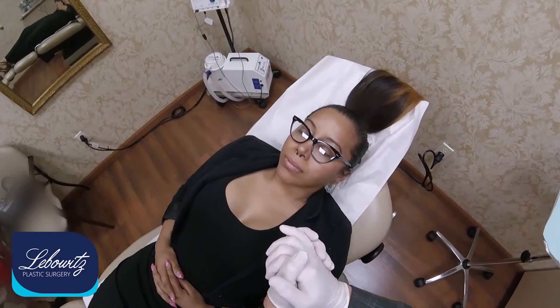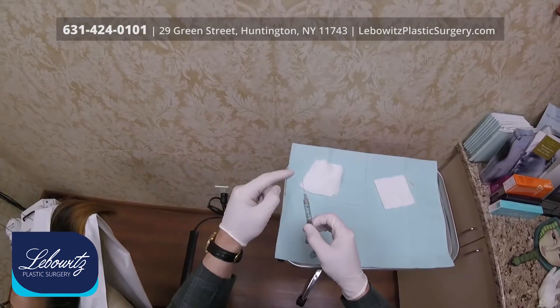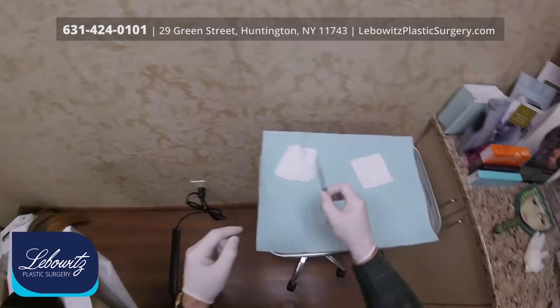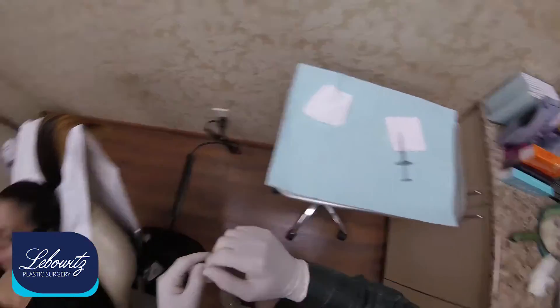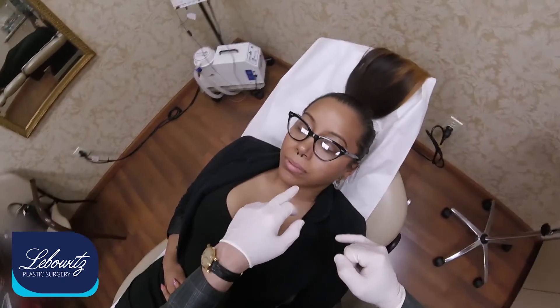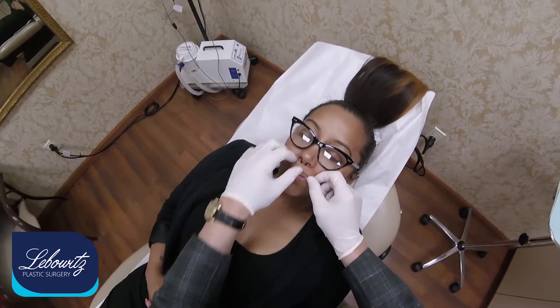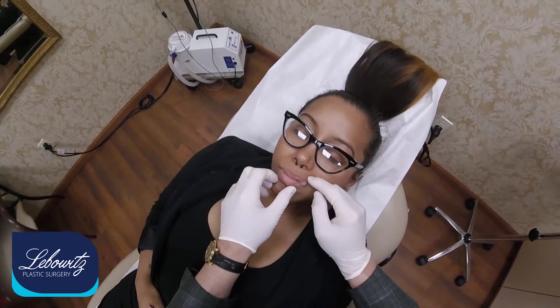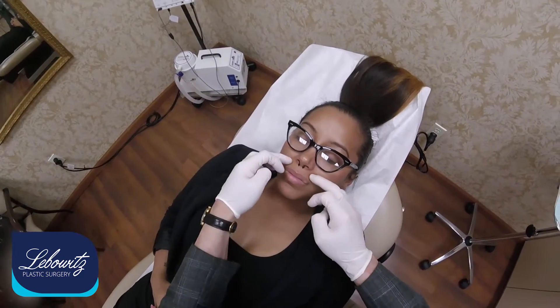With my blunt cannula technique, I have this blunt cannula — I'll show it to you. It's blunt right there, so it's not sharp. I go through a small area with a regular needle as a pilot hole in four different areas: upper, lower, upper, and lower. I've already given her some Novocaine — you can appreciate the little whiteness there. I've given her some lidocaine, like a dentist does, right in those areas. I've washed her up with some alcohol to cleanse the area and we're going to start.